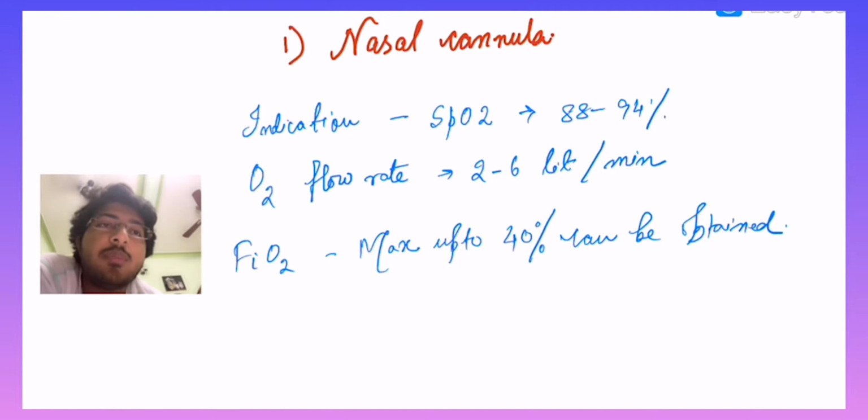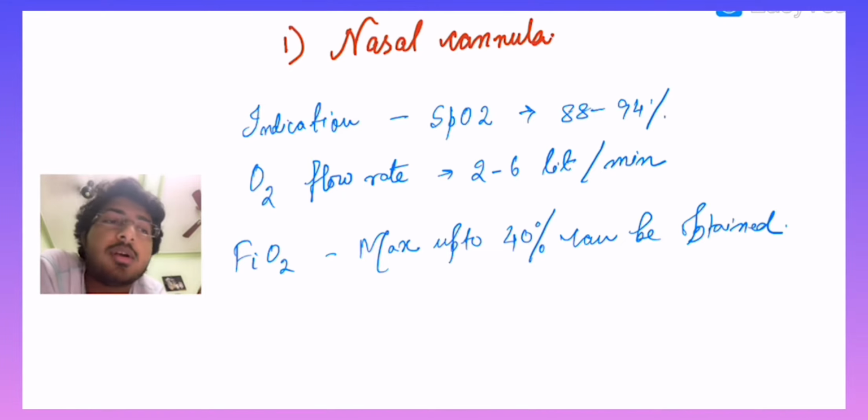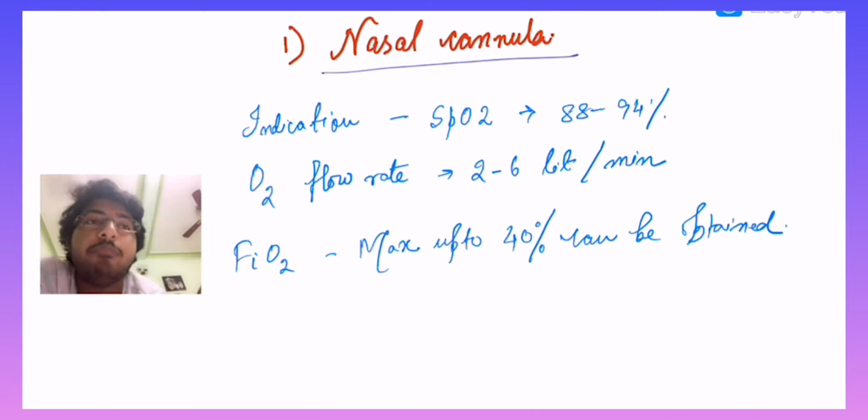So today we are going to make a video about how to use an oxygen cylinder in a home setup. We are facing a lot of problems in hospital setup, as most of the hospitals are not taking admission due to COVID positive report missing from a few patients, and that's why we are creating a home setup, and it's very necessary to increase the level of the oxygen. So I have just started a video which will be very much beneficial, I hope.